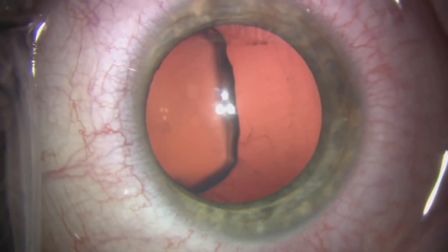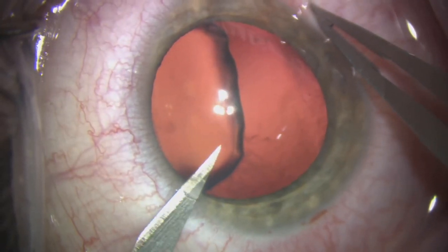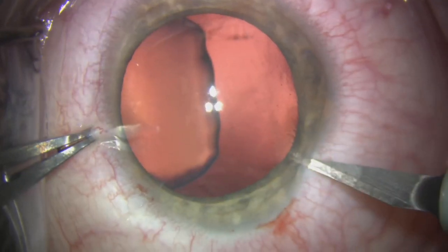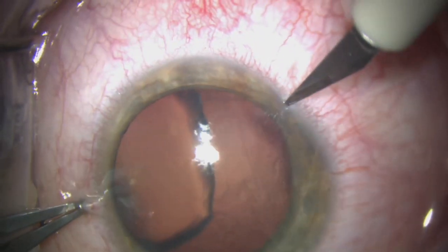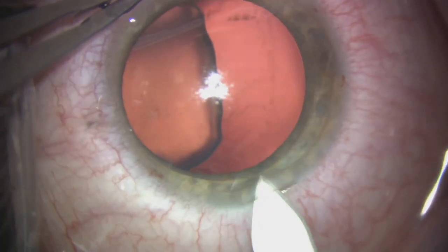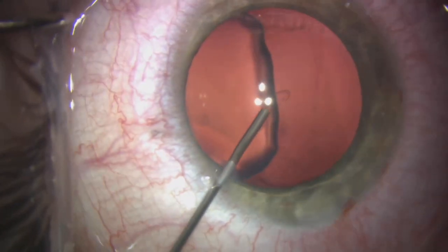This is a case of Marfan syndrome in a 23-year-old patient with a severely subluxed microspherophagic lens. The standard of care should now be to save the bag and not to disturb the vitreous — that is the aim of the exercise here. Although there is some zonular loss inferiorly and you can see the anterior hyaloid, the aim is to perform the procedure without disturbing the vitreous.